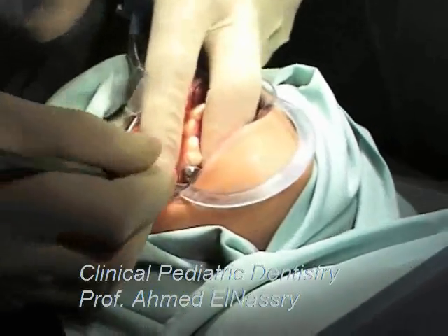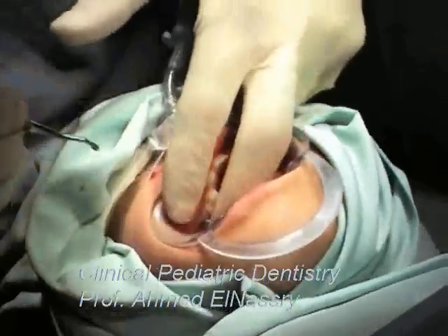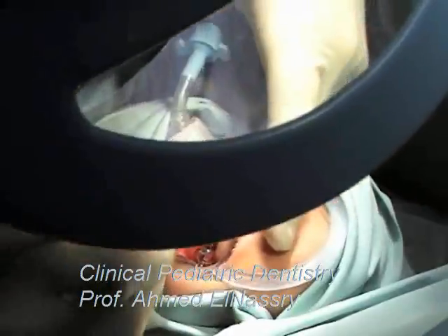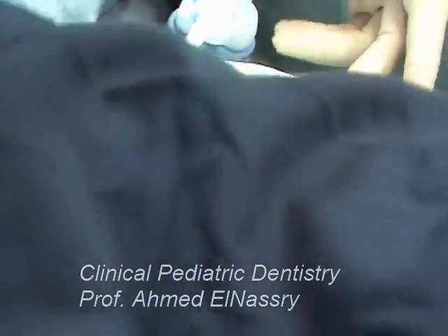After restoring the carious teeth, we selected the bands on the upper first permanent molars.